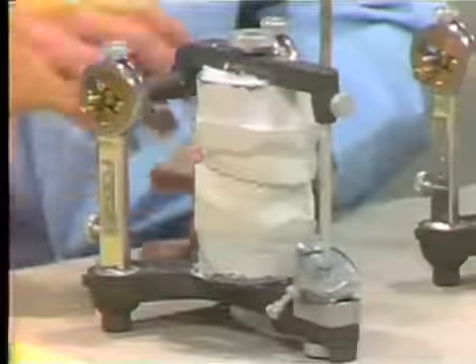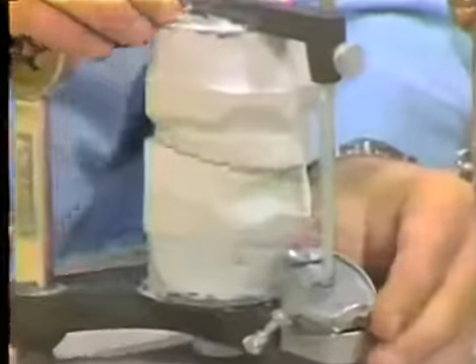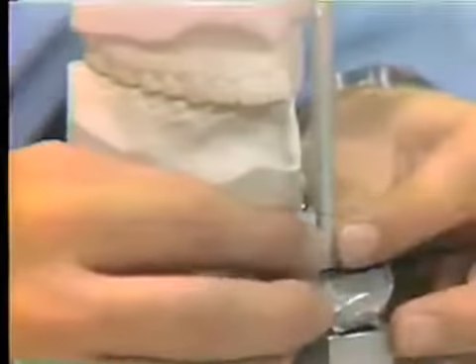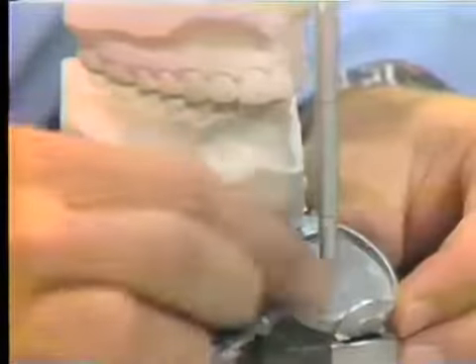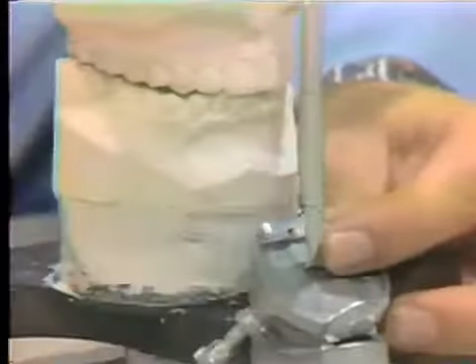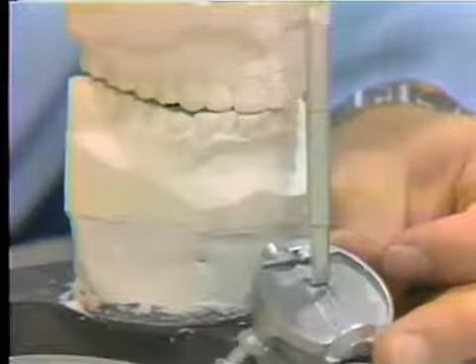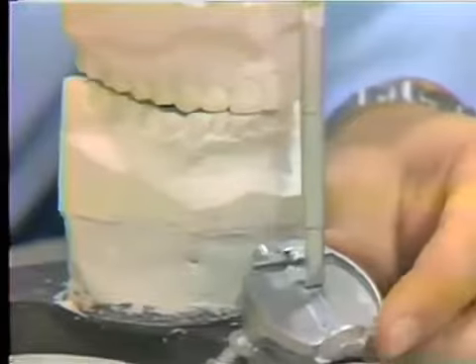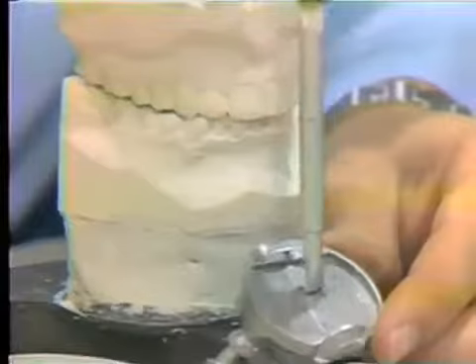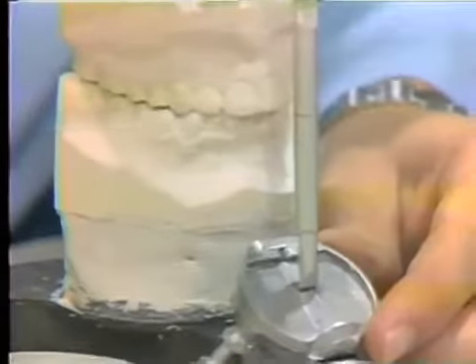The shallow incisal angle on this set of casts can be duplicated by the incisal table. If we go into the protrusive excursion here, and we bring the incisal edges into the end-to-end relationship, the table can be raised enough to clear these stone teeth and prevent the wear.